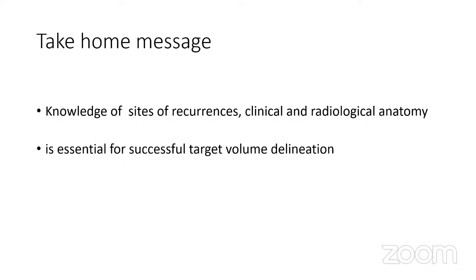So I have come to the end of the lecture now. The take-home messages for accurate target volume delineation: you need to have knowledge of these three things. One is where the sites of recurrence could be, so that you include that in your target volumes.